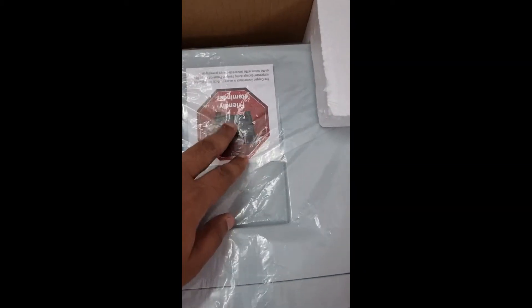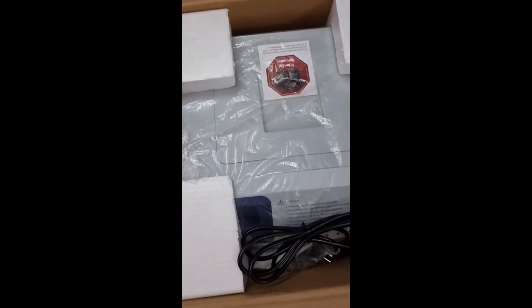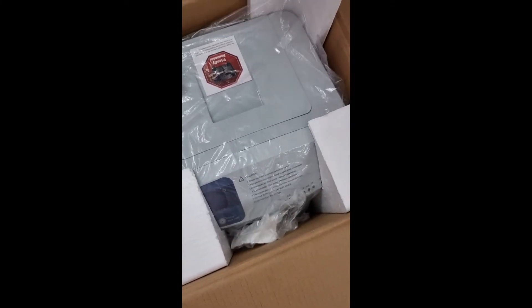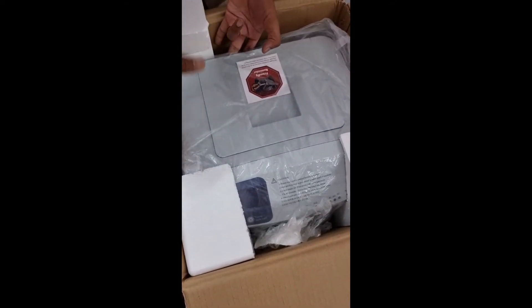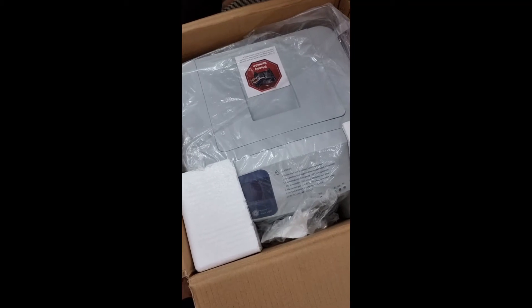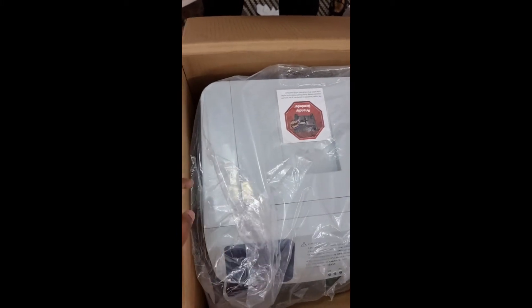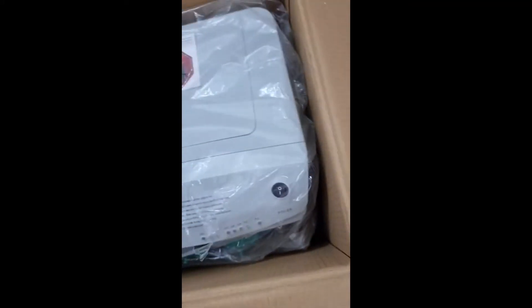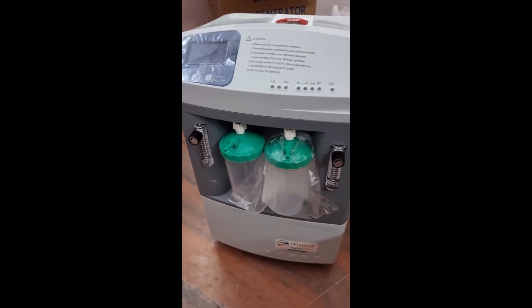There is also a friendly reminder to remove the compressor tag at the bottom, like the other concentrator models. Now carefully remove the side attachments — see how he is going to remove them. Keep everything safe so that whenever it is required to repack, you will be able to do it. He has now kept the unit outside.